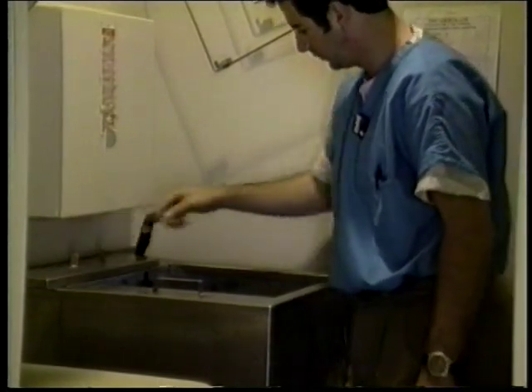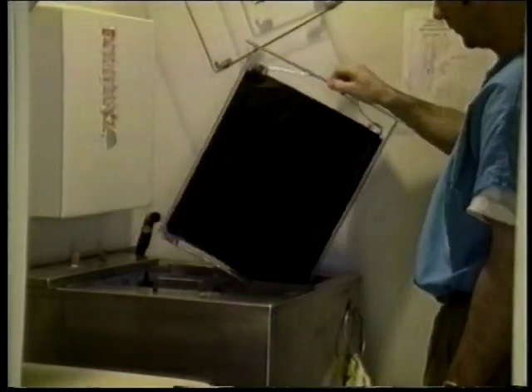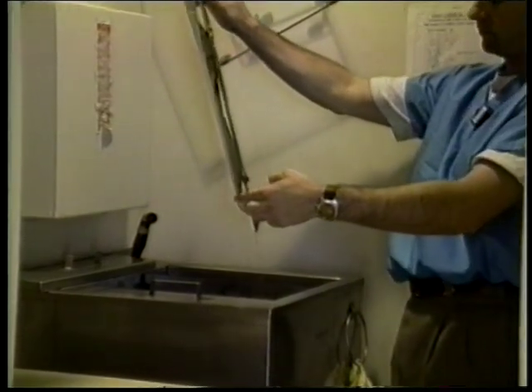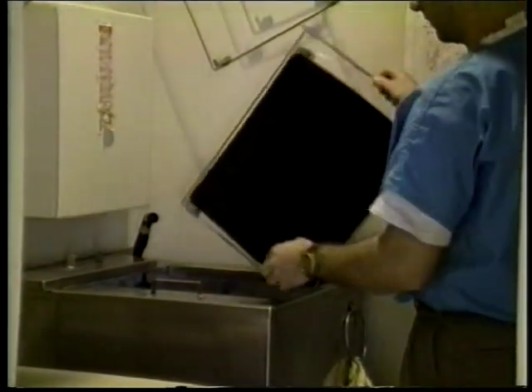The film should be left in the fixer for approximately 10 minutes, or twice as long as it remained in the developer. It can be removed and evaluated for brief periods of time after it has been fixed for at least 2 to 3 minutes. Light will have little, if any, influence on the film by this time.